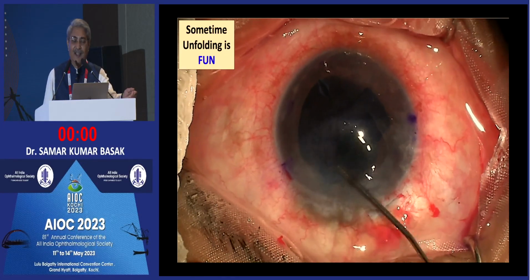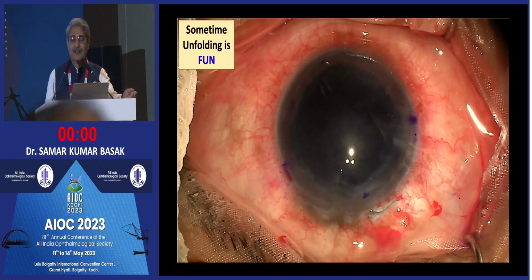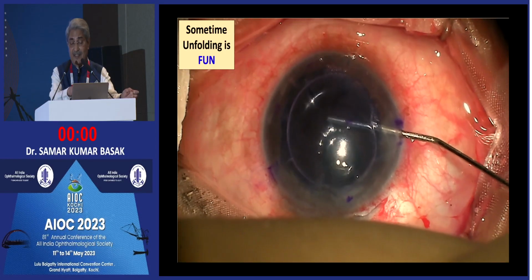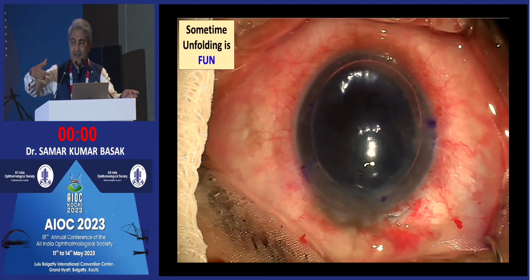When I am sure that it is open right, you put air and it is right. So there are several things, and you see this under your injector, I mean cannula.